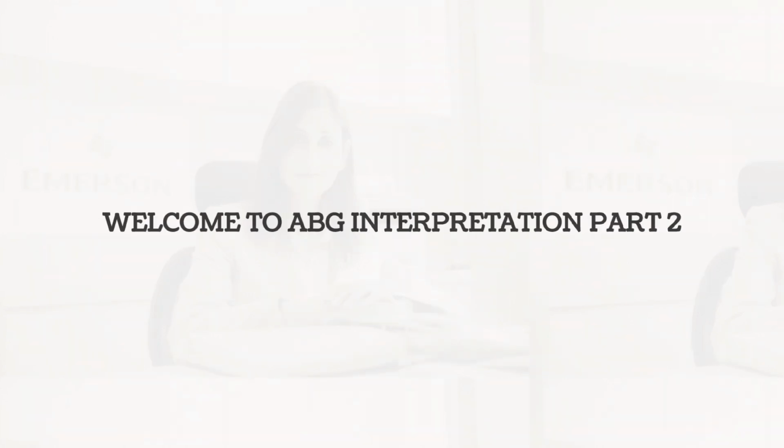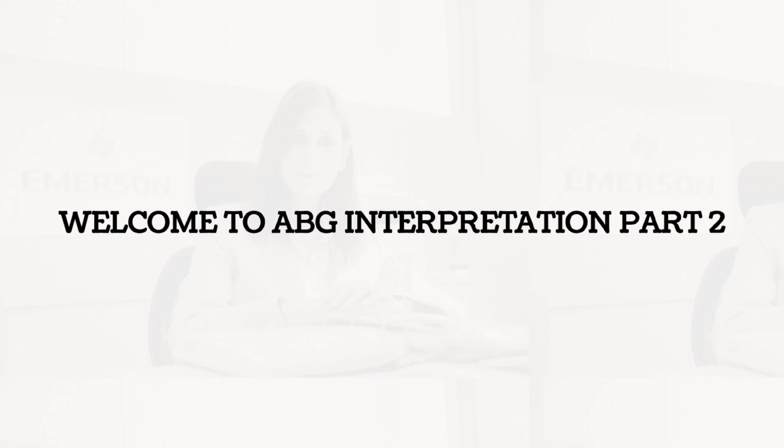This is the second continuation part for ABG interpretation. Part 2 for short, where we will continue from where we left off. We now know the pH and whether the underlying problem is metabolic or respiratory in nature from the CO2 level. Piecing this information together with the bicarbonate, HCO3 for short, we can complete the picture.